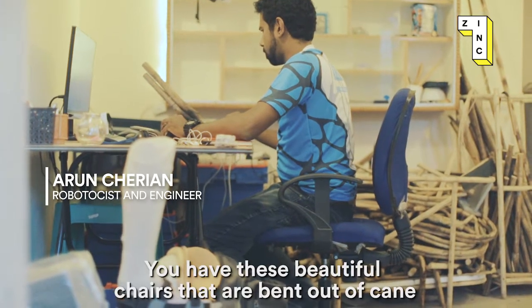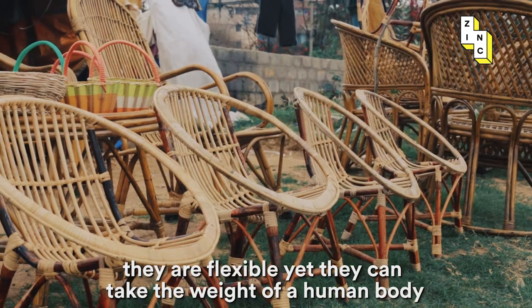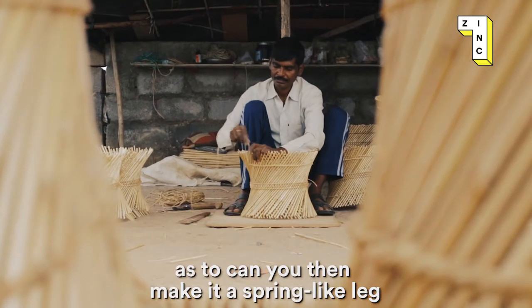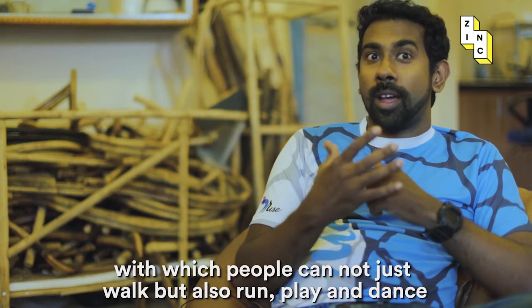You have these beautiful chairs that are bent out of cane. They are flexible but yet they can take the weight of a human body. So it really was a curiosity-based question: can you then make it a spring-like leg with which people can not just walk but also run, play, and dance?